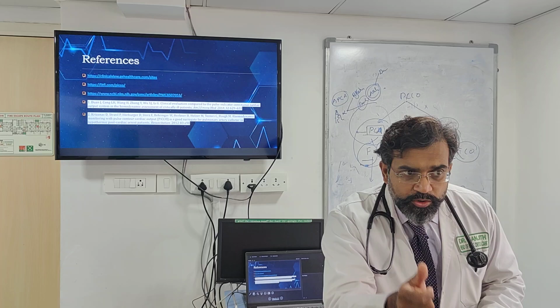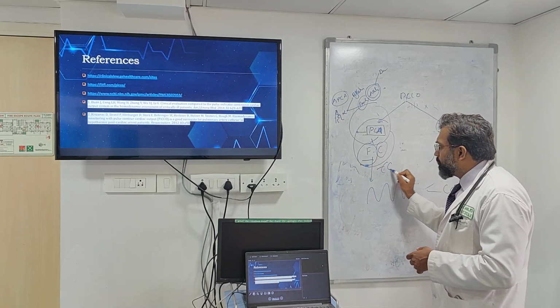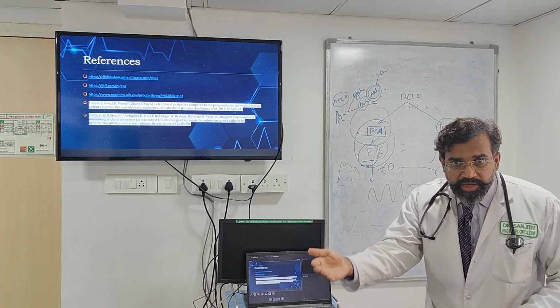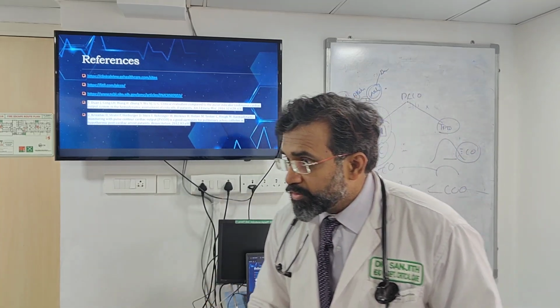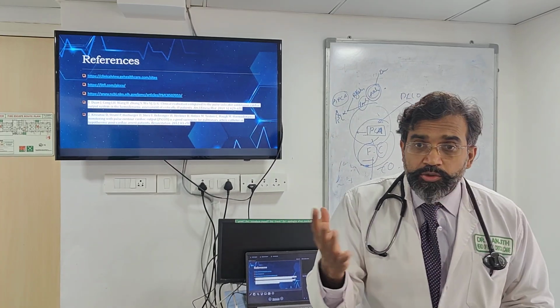Since the compliance is going to change, you cannot now depend on the cardiac output monitoring that you are getting from here. So what do I need to do at that stage? Again repeat the thermodilution so that I can tell him the compliance has changed. Now please look at the cardiac output again. Very important. Is it clear?